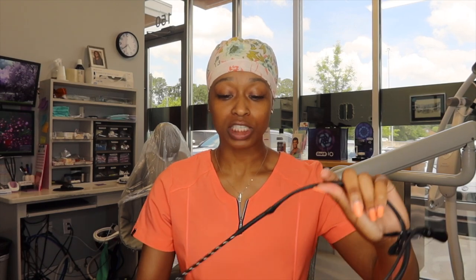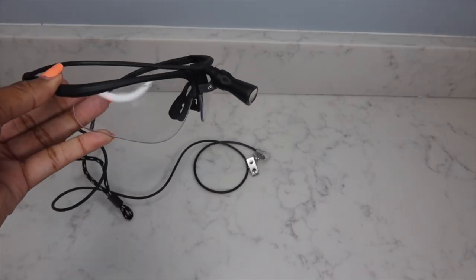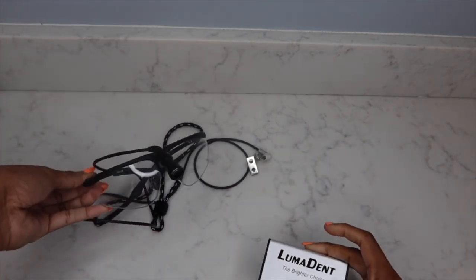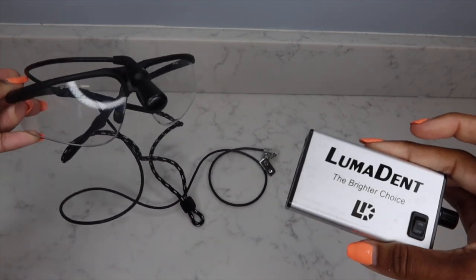With this basic kind, because it doesn't have a headlamp, you will have to have a chair that has an arm headlamp over you so that you can illuminate the mouth and be able to see. The next pair I want to go over is the same exact protective eyewear except it has a headlamp, which discards the need for a chair with a headlamp. Our operatories don't have chair lamps, so we have to have protective eyewear that comes with a light.